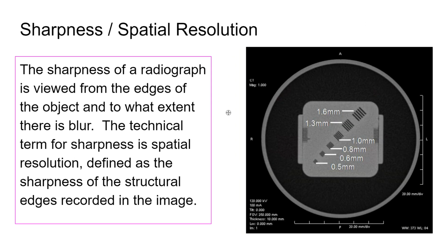This is not good, even though you can see the lines, because if you had two objects in between these two lines, in that space, then you wouldn't be able to tell them apart. The closer the lines are together that still have a space, then you can theoretically separate one object into one line pair and the other object into the other. If they're both small, it doesn't work that well.